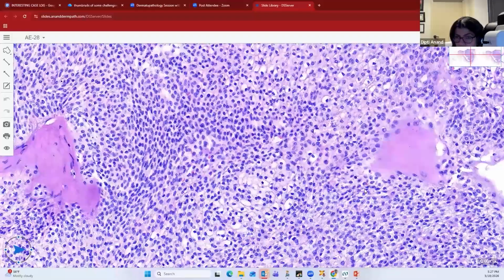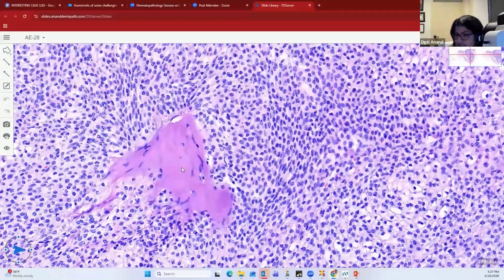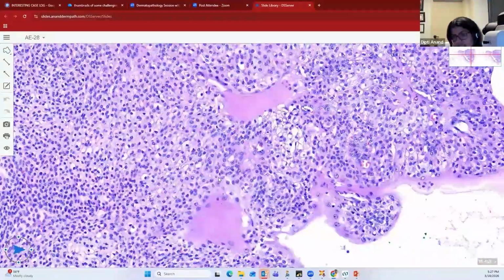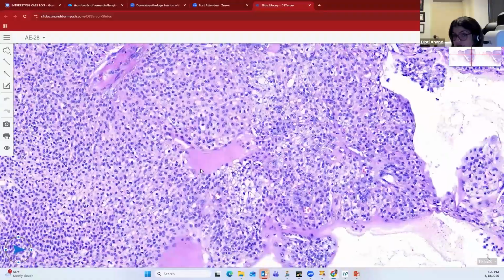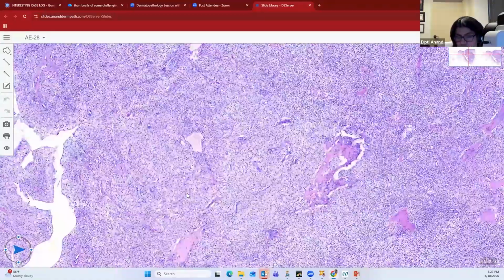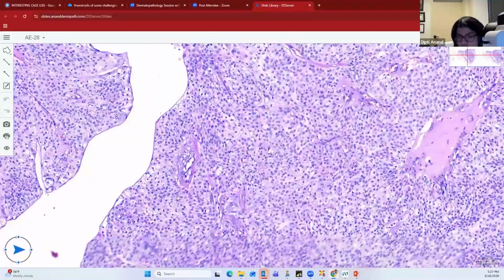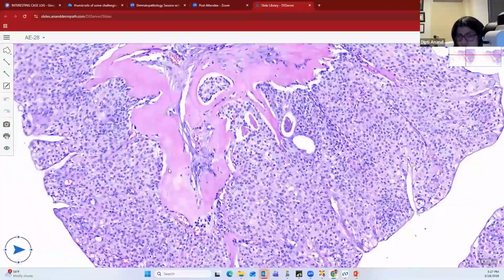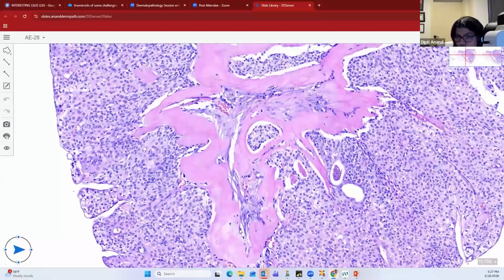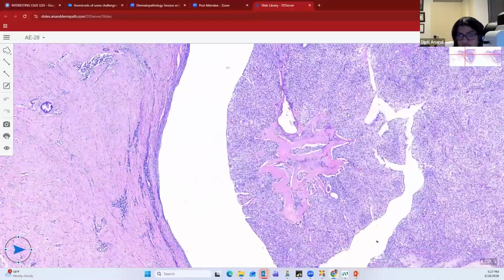And another important component of the lesion is the stroma. As you can see here, the entrapped stroma is very dense and hyalinized, which is called a bubble gum or chewing gum kind of stroma. You can see the nice dense pink hyalinized stroma. That's an integral component of a hidradenoma. And then you can see that it is also going to form glandular and ductal elements. As you move around the tumor, you can see the nice ductal elements being formed. But again, please recognize this nice densely pink hyalinized stroma, which is useful in recognizing a hidradenoma.